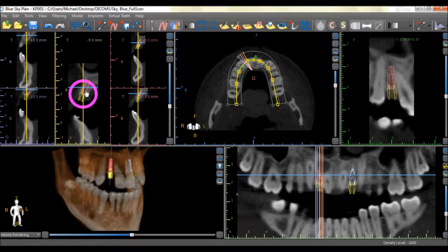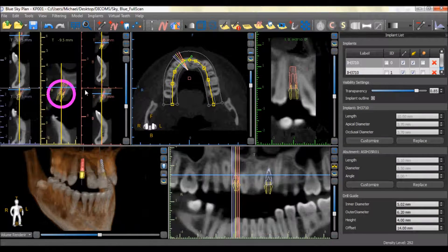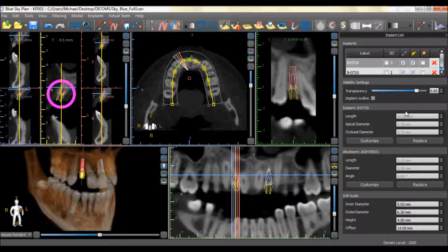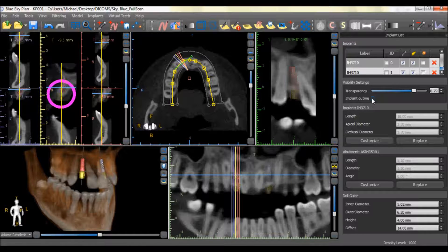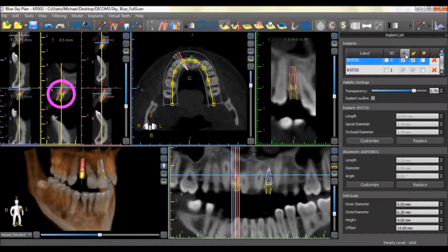Double-clicking on an implant will open the Implant Properties panel. This panel allows the user to control the properties of the implant, such as adjusting the transparency of the implant, displaying or not displaying the outline of the implant, and displaying or not displaying the implants, the abutments, and the implant ID number.